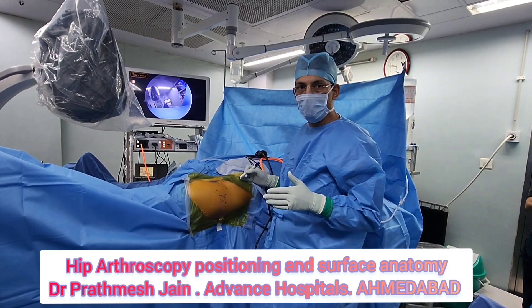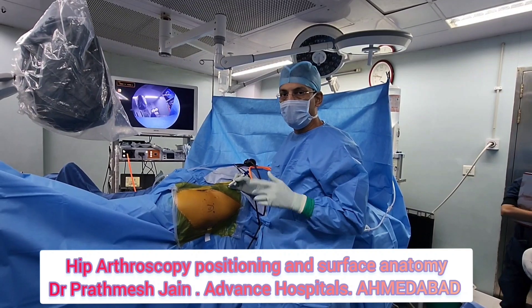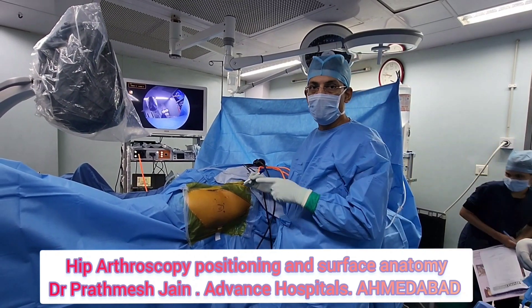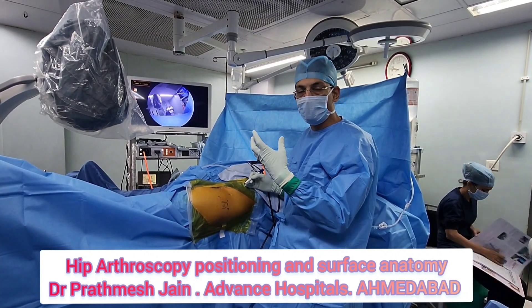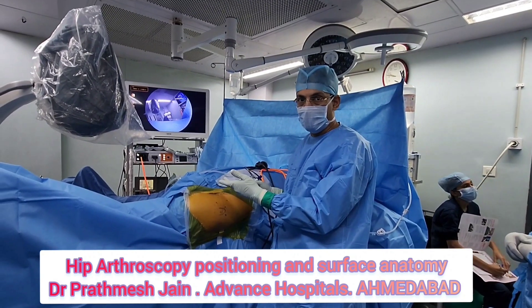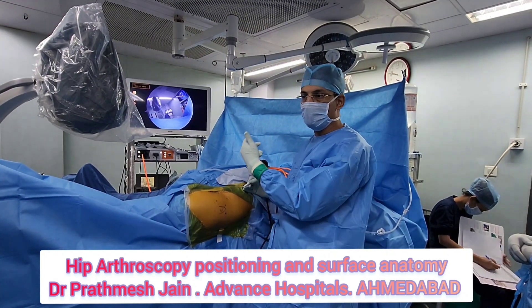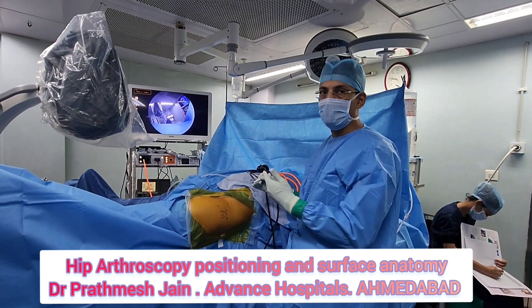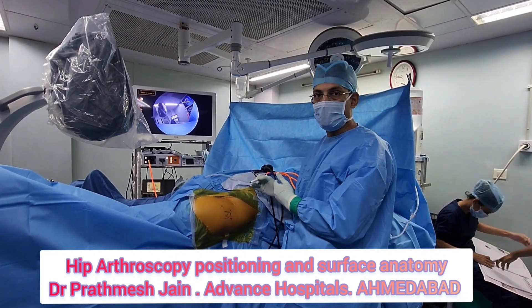Most of the work in the peripheral compartment will be on the anterior part of the femoral neck. If you have a synovial pathology — such as loose bodies or PVNS — most of the work will be done in the peripheral compartment. For the central compartment, you work if you have a labral tear or need to perform labral repairs. So, let's start with the procedure.